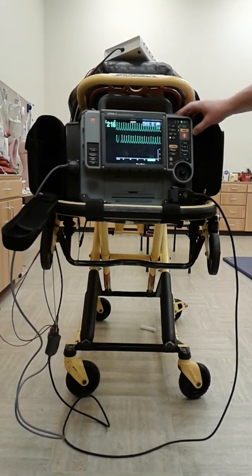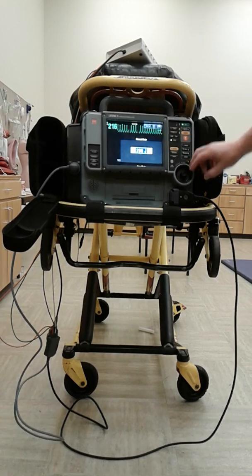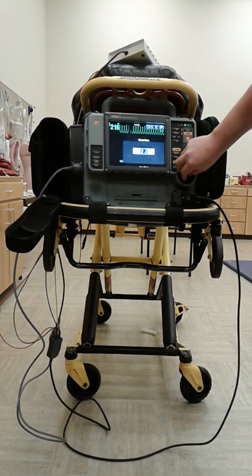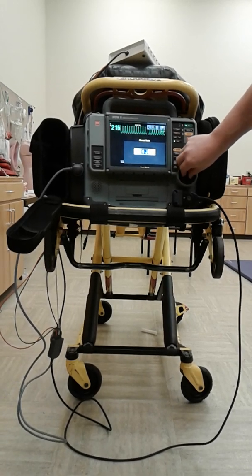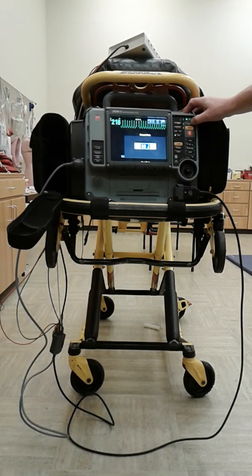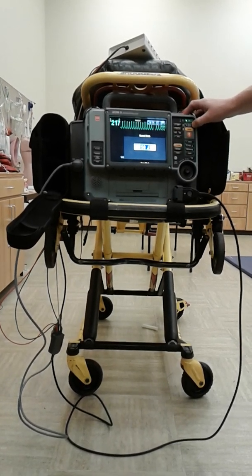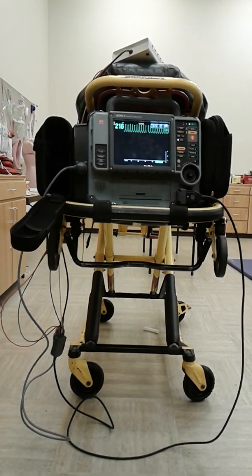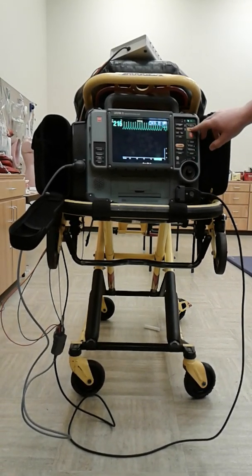Now we're going to set the energy select. We're going to select the joules we want to shock them at. Okay. We'll just say 50. Is there a standard of where you should start? I'm going to talk about it. Now, you can hit that and lock it in, and then you hit charge.